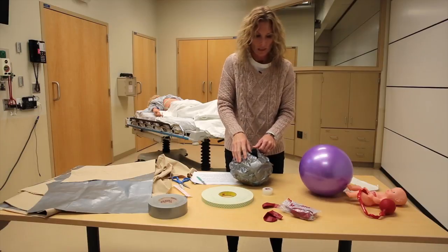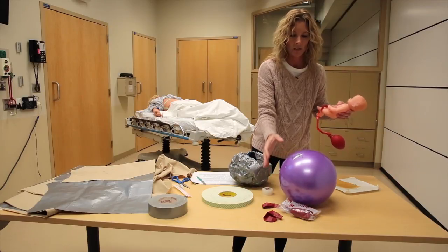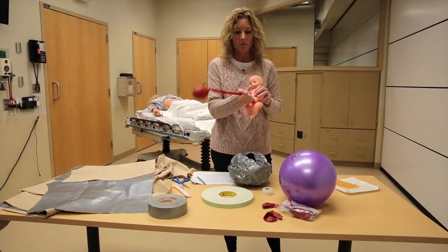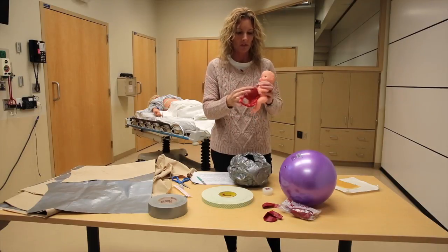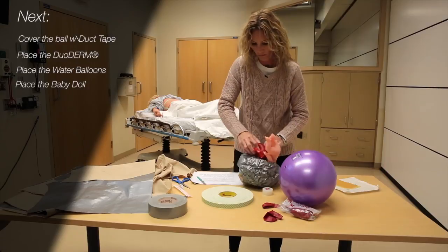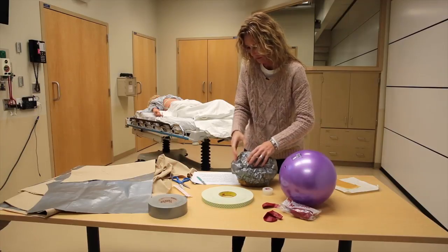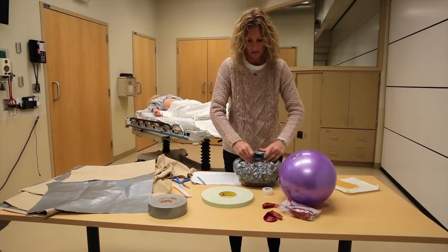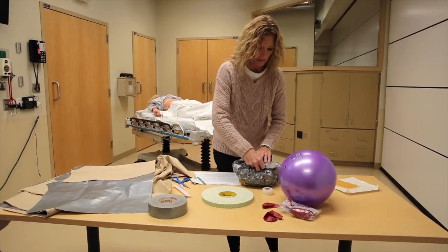So the water balloons go in first. Then take your baby. I originally used baby Natalie and the placenta that came with that. For this one, I purchased the baby at the discount store and used some red tape to indicate the umbilical cord with a barely filled balloon at the end — just something that resembles the placenta and umbilical cord. Place the baby in next. Once the baby is in, seal the back section — make it nice and snug, make sure the water balloons are in place. Then put a piece of duct tape over that to secure it.